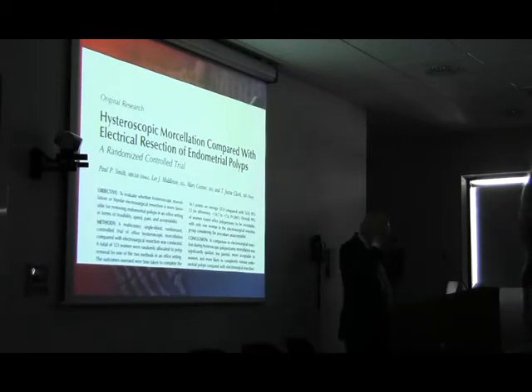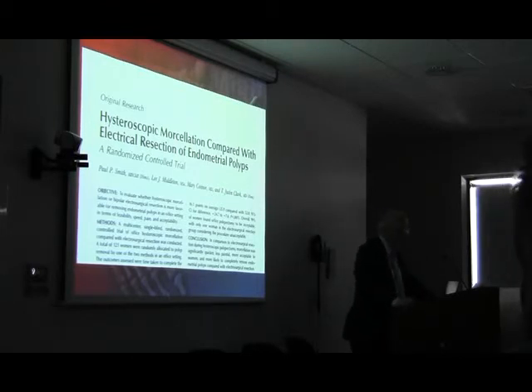Now, for those of you who are reading the Green Journal, there's a paper out in April on hysteroscopic morcellation compared to resection for polyps, and the senior author is none other than Justin Clark. Congratulations on another fine paper from Birmingham and Sheffield. In comparison to electrosurgical resection during hysteroscopic polypectomy, morcellation was significantly quicker, less painful, more acceptable to women, and more likely to completely remove. So in every way, I suppose, apart from the cost. Anyway, a better gadget.